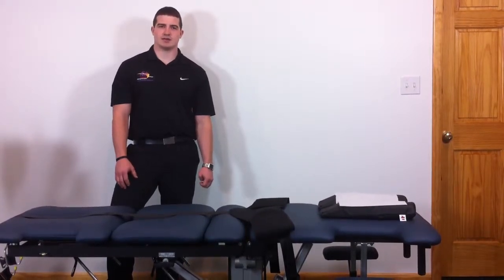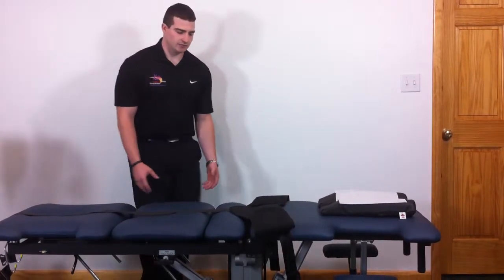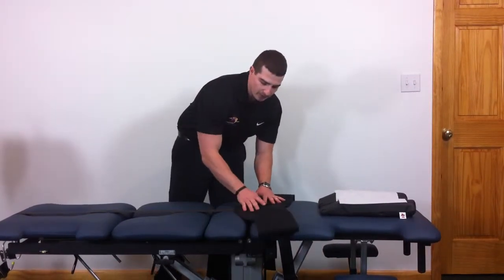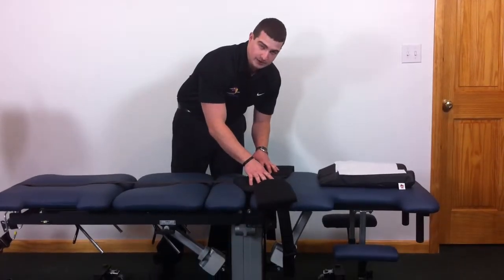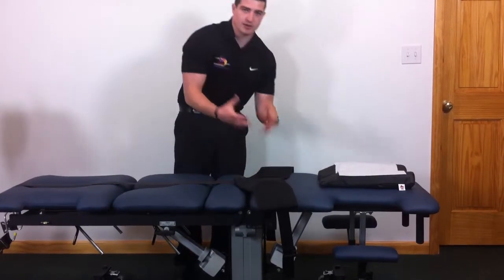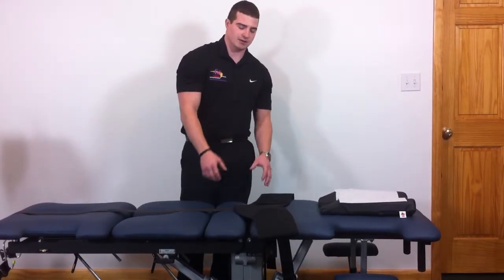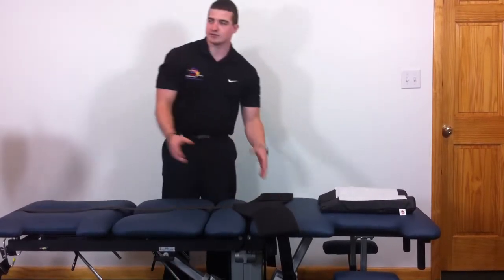Hi, this is the instructions for the Kennedy Technique on applying the open modality belt to the patient. We are going to first start with the belt above the split in the table a little bit so it can be properly put on the patient's body. You adjust these flaps based upon body girth, how big or small the patient is. You should want to have them adjusted somewhere in the middle to start out with.